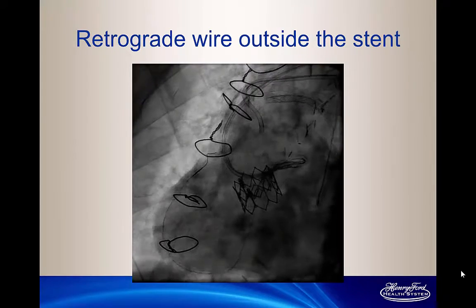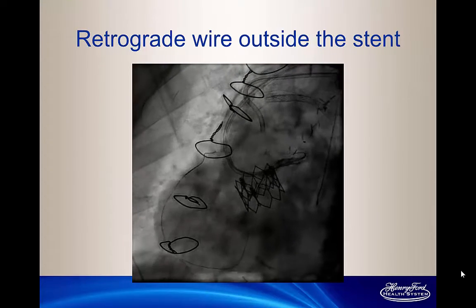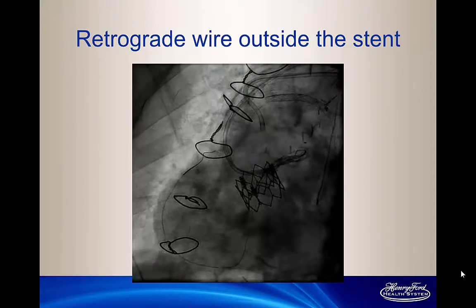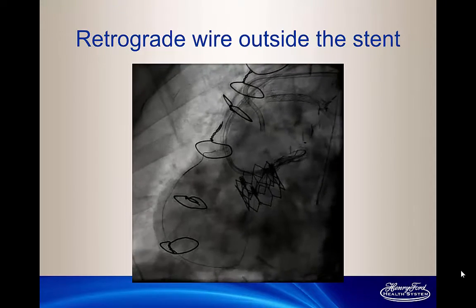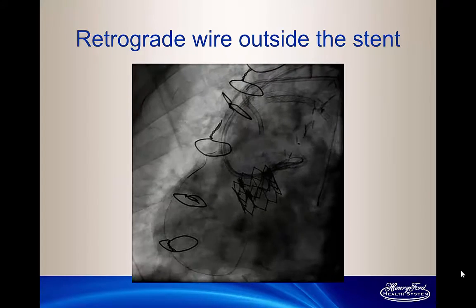We advanced a retrograde microcatheter all the way to the proximal RCA. We have an AL 0.75 with side holes guide sitting and waiting in the aorta. My hope was to cross retrograde and basically snare the wire, because we don't even have an antegrade picture of the RCA. However, as usual, nothing goes as smooth as expected. The wire would go outside the stent, and we tried several wires, but the wire continued to go outside the stent retrograde. We did a CINE run, and looking at the stent more proximally, I changed the guide from AL 0.75 to JR 4.